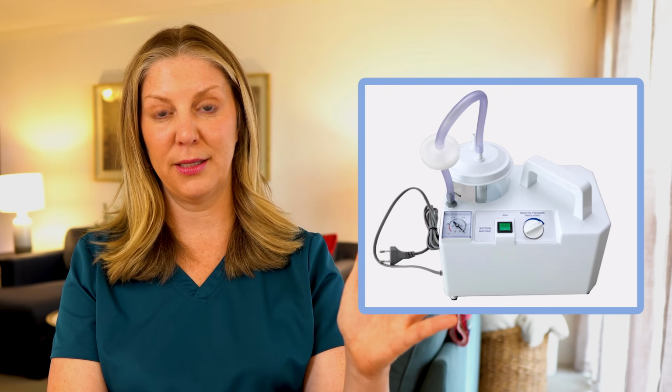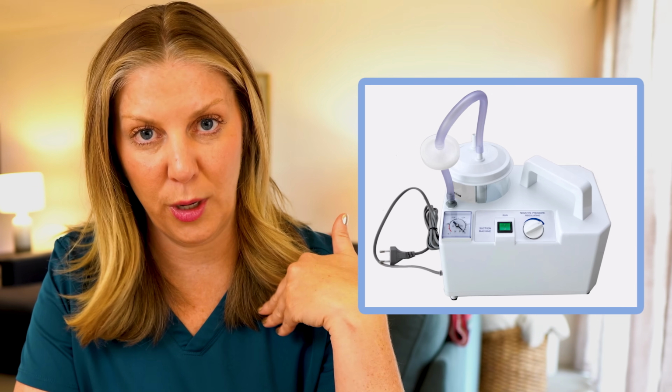Now, suction machines. Also a love-hate thing here on hospice, to me anyway. We do provide portable suction machines, so when people have terminal secretions or excess secretions, nothing to do with the death rattle, just for whatever reason their disease is causing them to have excess secretions, we can provide a portable suction machine. I don't particularly like them because people will use them a lot for end-of-life secretions, and it actually causes terminal secretions to get worse and cause more production of saliva. I usually try to educate people about why we don't want to use suction machines. However, if needed, we do have them.